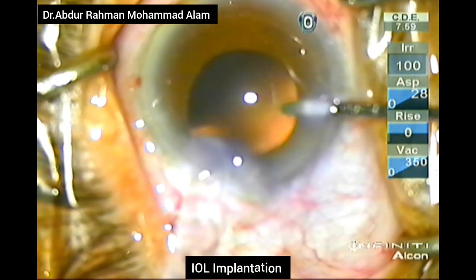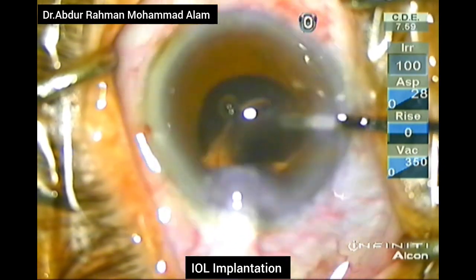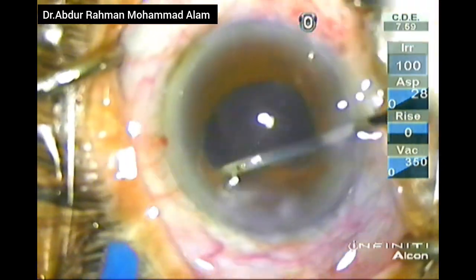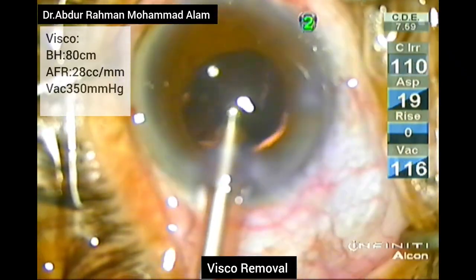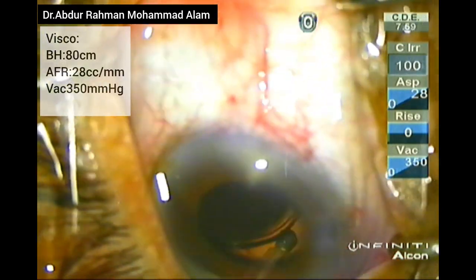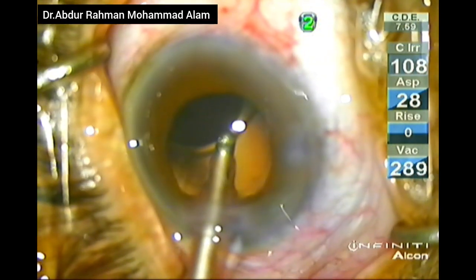Now I am implanting the IOL into the capsular bag. With the help of a spatula, I will dial the IOL into the posterior capsular bag. Now the only remaining part is removing the OVD from the anterior chamber and from behind the IOL.